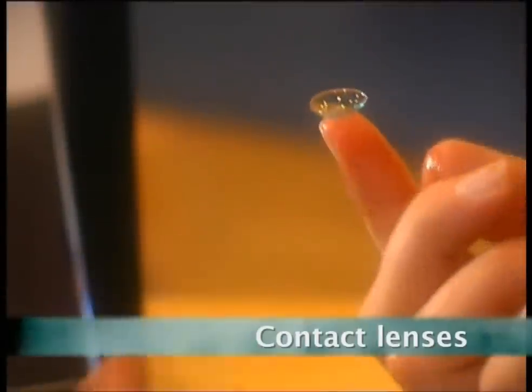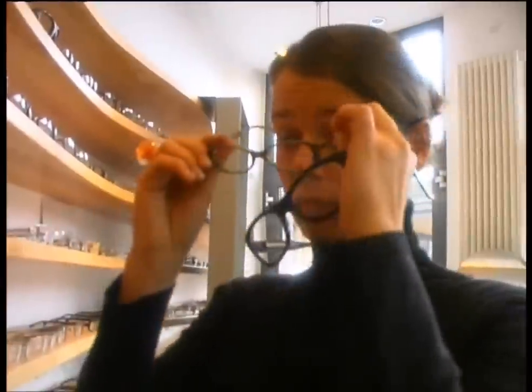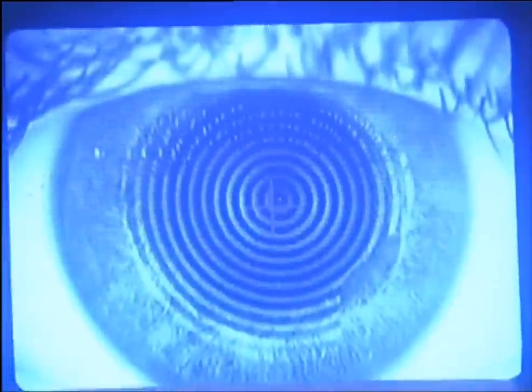Contact lens manufacturers started commercially producing them in the 1970s. Up until then, if you were short or long-sighted, your choice was pretty much the shape and color of your frames. Now for many, it's a choice of hard or soft lenses. But what's the difference? Hard lenses are rigid and are designed to fit an individual eye perfectly.